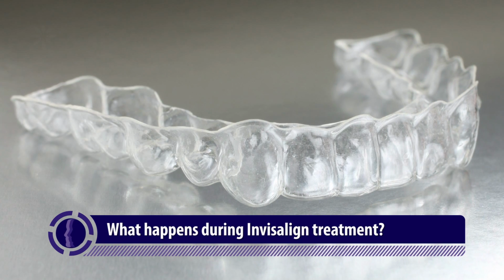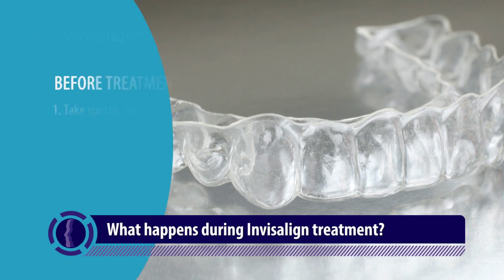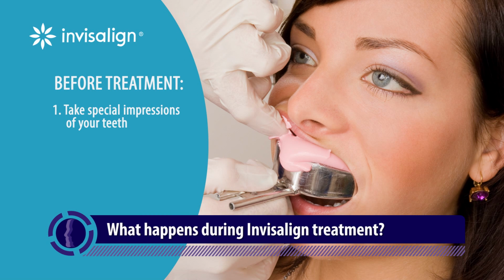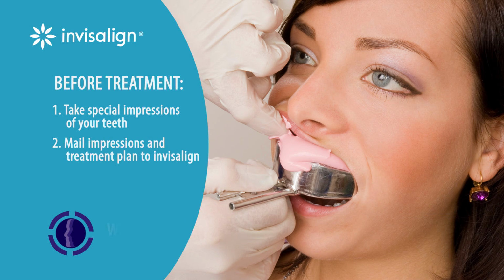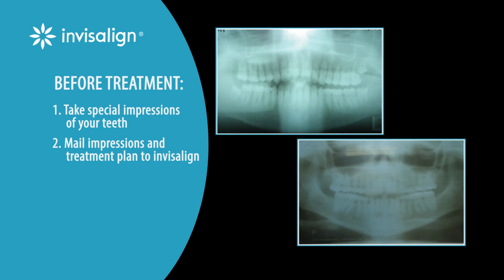So if you come in and we determine you are a candidate for Invisalign, what we do is have to take special impressions of your teeth. We mail those impressions to Invisalign, and based on the treatment plan that I came up with from you, from our clinical exam, and from the photos and x-rays, I will sit down and type up a detailed treatment plan of exactly how I want your teeth to move.